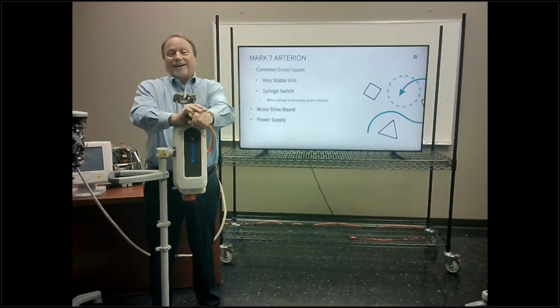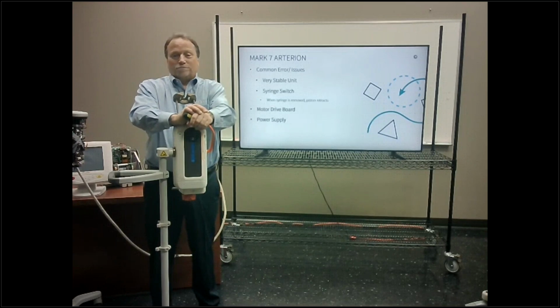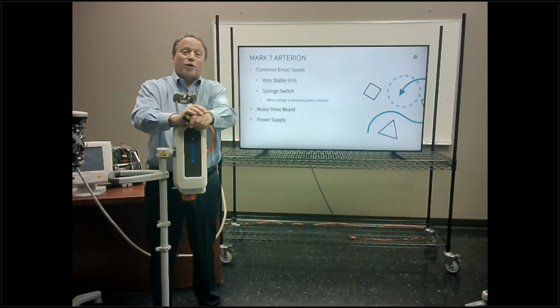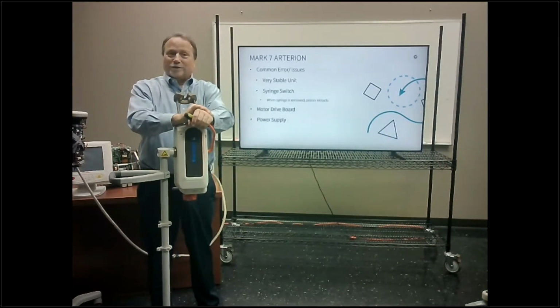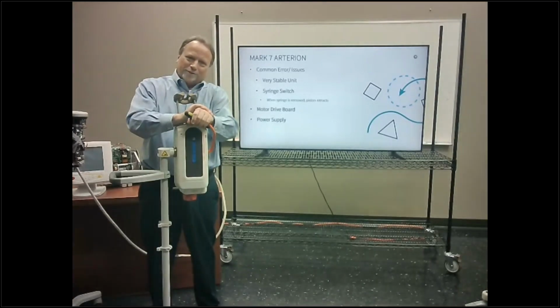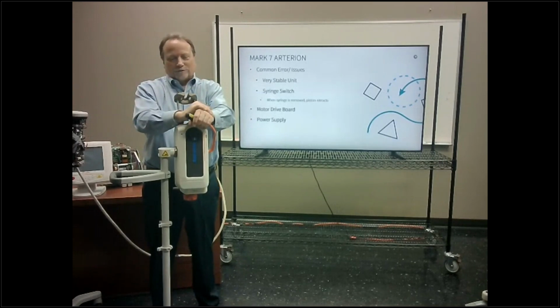Now, I did that one time, and luckily it was in training. I put a new 48-volt power module in it. And Stacy, if you're watching, I'm sorry, but when she plugged it in, we had flames going about 2 feet behind it. It just shot right out and blew components all over the place. It was quite an enlightening experience. So I highly, strongly recommend that you replace all 3 power modules.